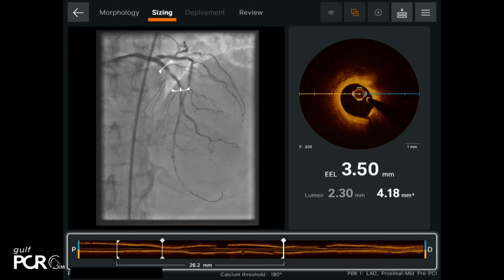And if I can add to that, if you have circumferential calcium that appears to be thin, a cutting balloon or even just a high pressure NC balloon inflation might be enough. If you have thicker circumferential calcium that's less than the size of a burr that you're planning to use, that might be effective. If it's bigger than the burr, let's say in the left main with a minimal diameter of 2.5, then a burr of 2 will not do anything, in which case you'll use a shockwave, for example. But to be honest, more frequently now we are using combination calcium modification therapy.